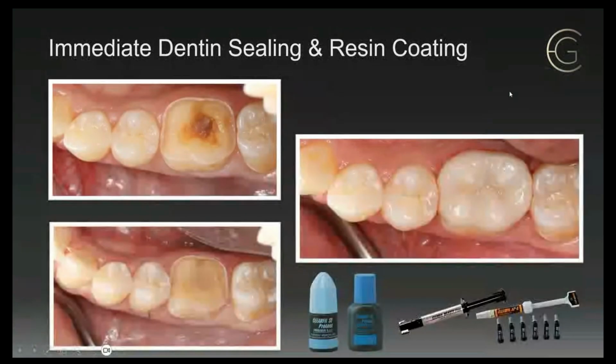All right. So let me show you a case real quick, and I want to get into all this other stuff we're going to talk about. Look at this nasty tooth. This is my first case that I did with Katana Zirconia because people kept telling me online on the board.